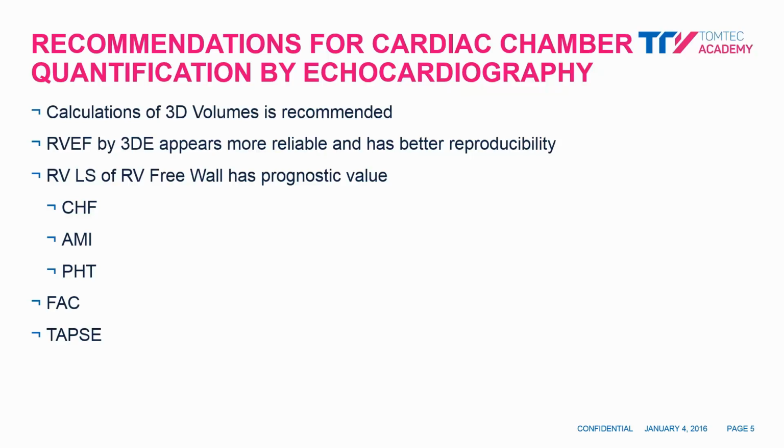In regards to both the fractional area change and TAPSE measurement, we were able to realize the significance in these values even when manually calculated. So having a solution that provides an automated means of calculating these parameters only increases accuracy and reproducibility.